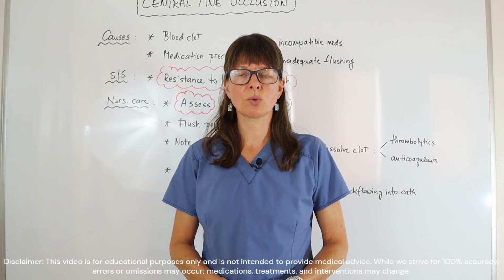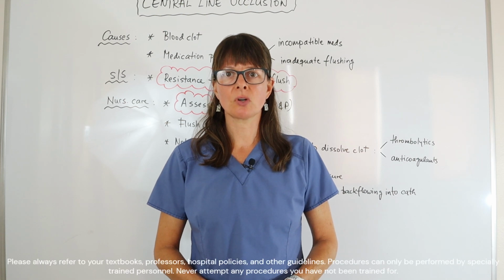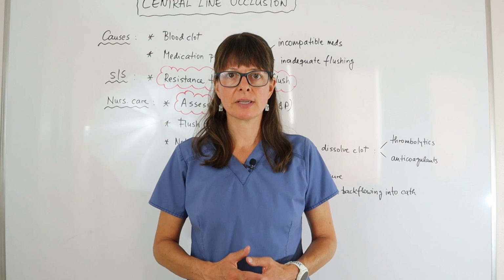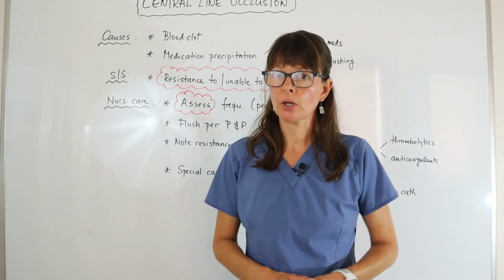Welcome to Nursing School Explained, and this video on occluded central lines, which is a complication that can arise if a patient has a central line, and then we need to know how to troubleshoot it. So let's take a look at this.